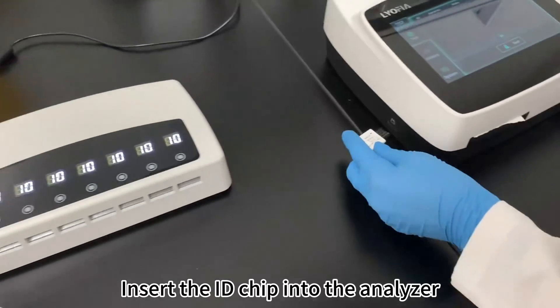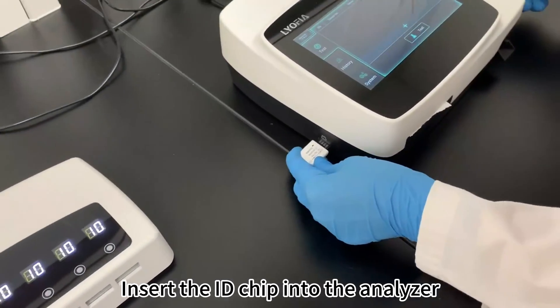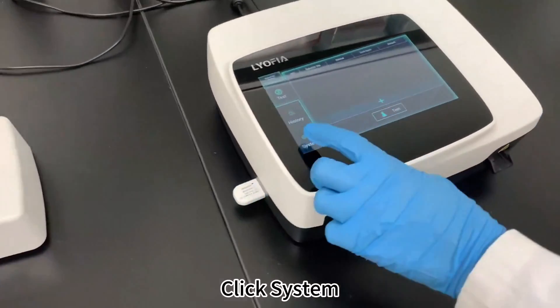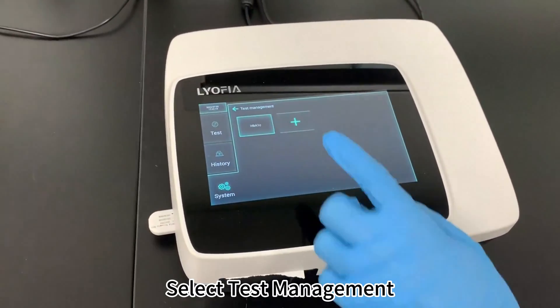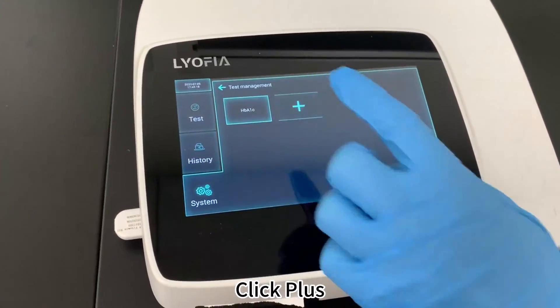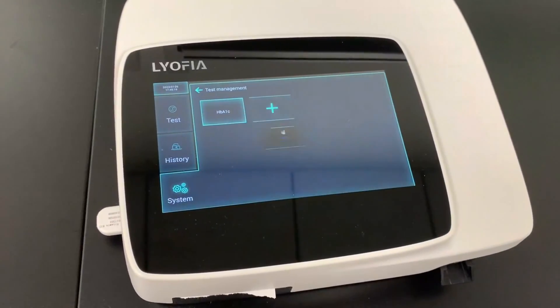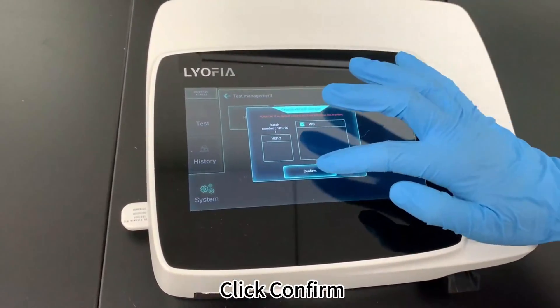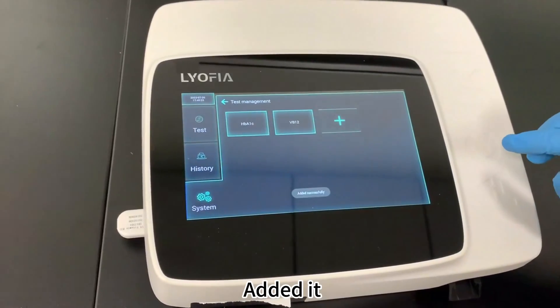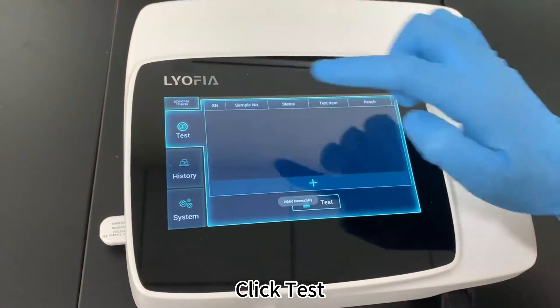Insert the ID chip into the analyzer. Click System. Select Test Management. Click Plus. Select Sample Type. Click Confirm. Add Date. Click Test.